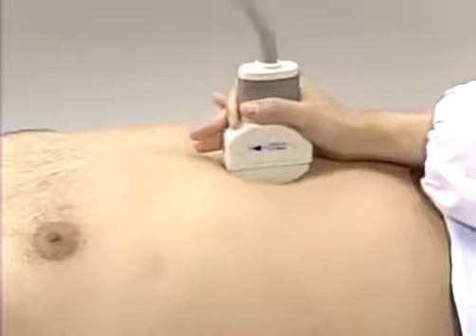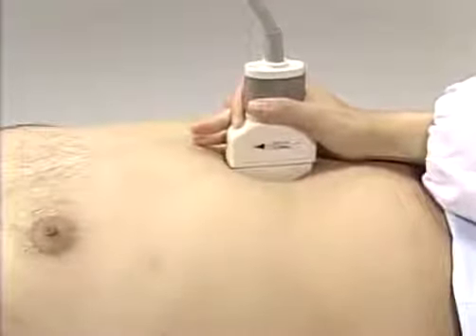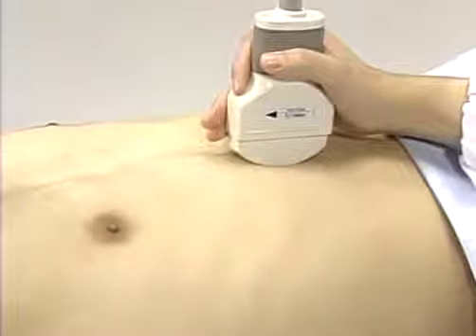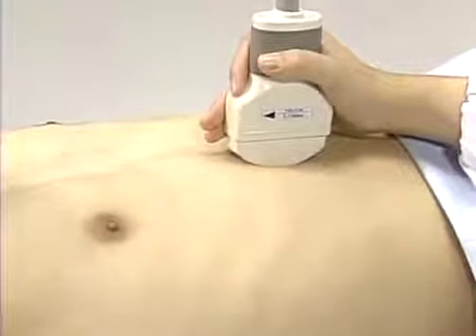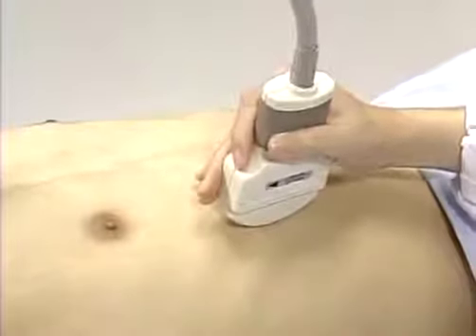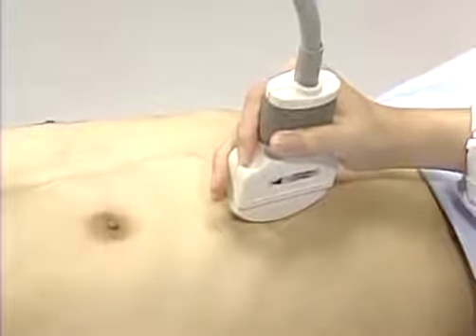If the patient is rather obese, press the probe firmly against the skin. If the patient is lean, press the probe lightly on the skin. In both cases, if the probe corner is pushed down too forcefully against the ribs, it will cause pain to the patient.